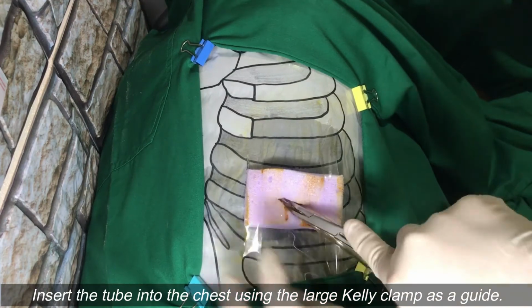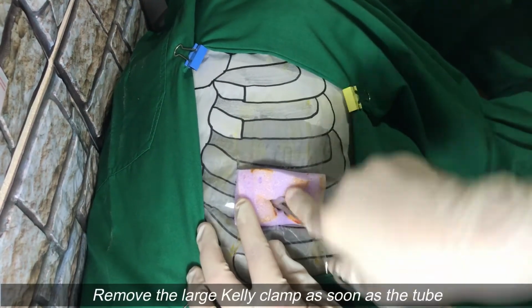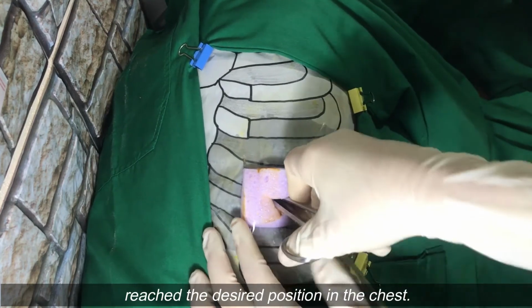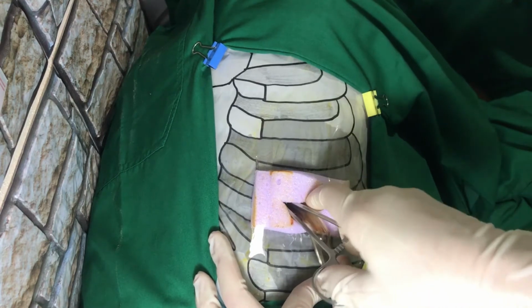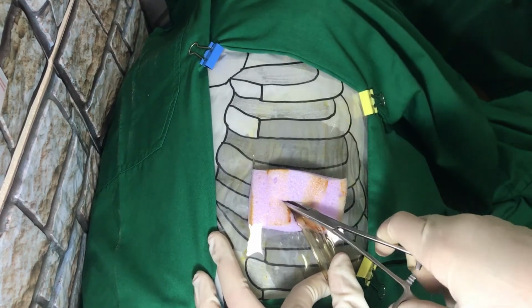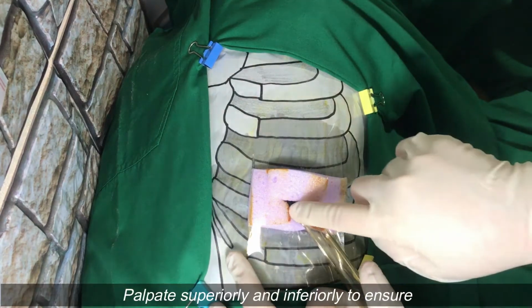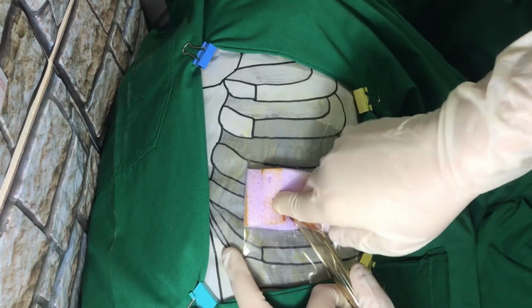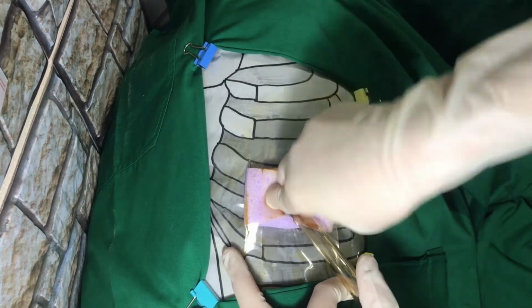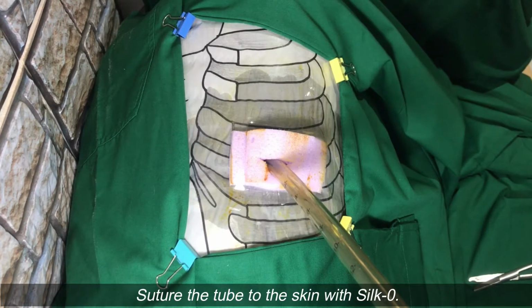Insert the tube into the chest using the large Kelly clamp as a guide. Remove the large Kelly clamp as soon as the tube reaches the desired position in the chest. Palpate superiorly and inferiorly to ensure that the tube has entered the chest. Suture the tube to the skin with silk O.